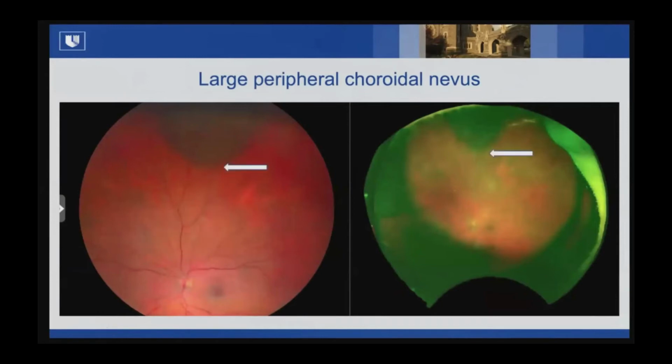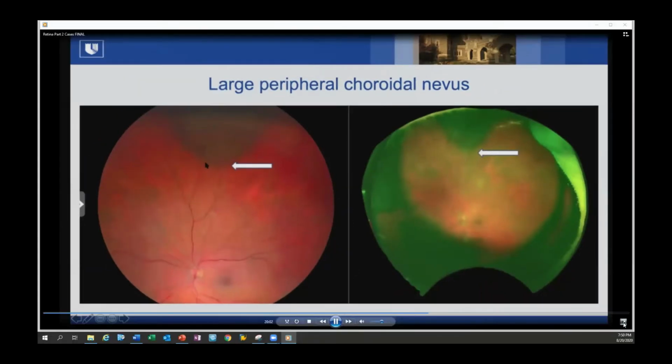very, very important to see the details, and the way we compare images is by seeing any documented growth, checking on monitoring any documented growth. So we look at the blood vessels, and clearly it's easier for us to evaluate with a more real color these large peripheral lesions.